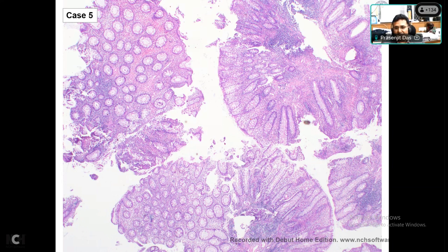Okay. So if you see there is a discordance, because pathology, what is pathology? Pathology, we are slaves of sampling. You have to always remember. Ma'am sees so many soft tissue tumors and other tumors. So if it is not sampled, you will not see. So the area of sampling is very important. So whatever you are seeing, if it is not matching with the clinical presentation, just say it may be perilesional, or we say it is not diagnostic. Yes, sir. Thank you, sir.